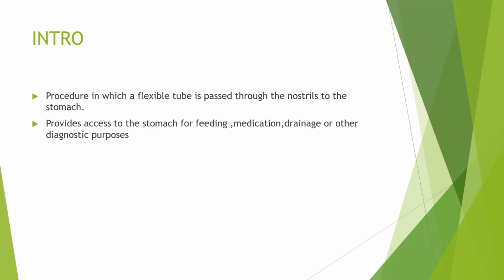Let's go to the introduction. NG insertion is a procedure in which a flexible tube is passed through the nostrils to the stomach, and it provides access to the stomach for feeding, medication, drainage, or other diagnostic purposes.